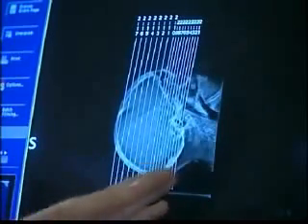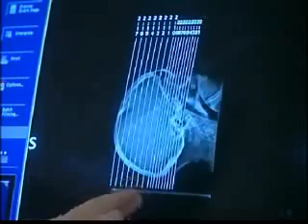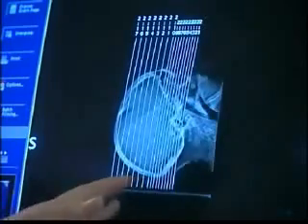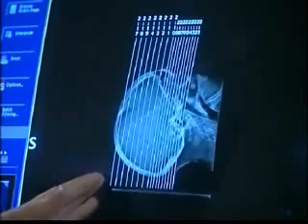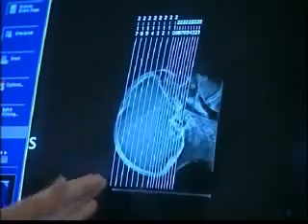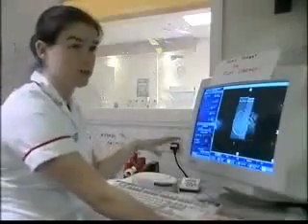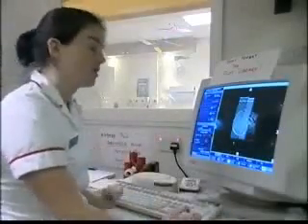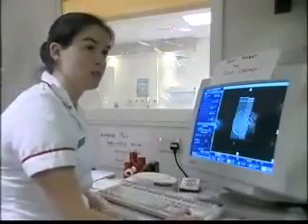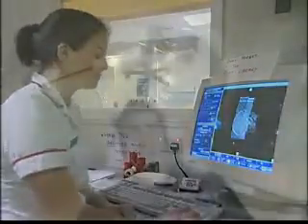We're going to do thin sections through the base of the skull, and then wider ones as we go through towards the top of the skull. So now we can do our actual scan and produce the actual images that the radiologists will look at.